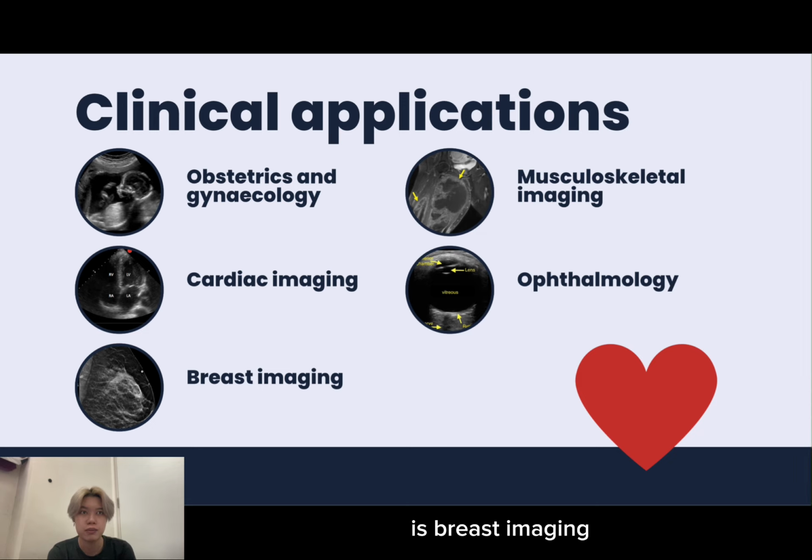Thirdly is breast imaging. A safer and more effective method of checking the breast for suspicious lumps that might be malignant is with breast ultrasounds. These are starting to become the standard procedure for these kinds of tests. Ultrasonic guidance is the standard method used for breast biopsies, directing the probe to extract the desired piece of soft tissue for analysis. Fourthly is musculoskeletal imaging.